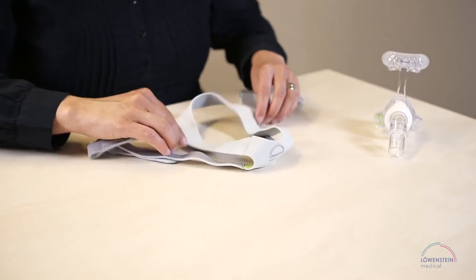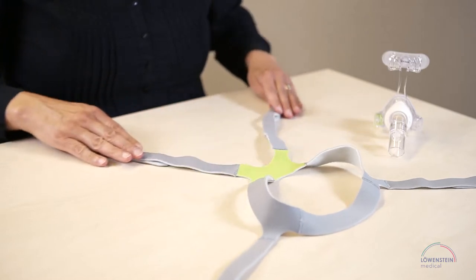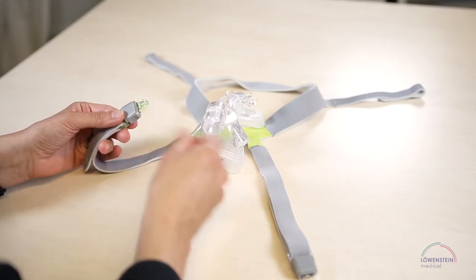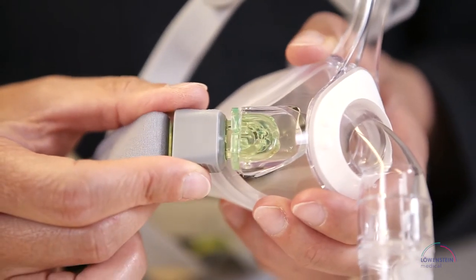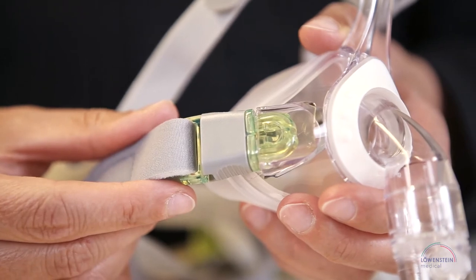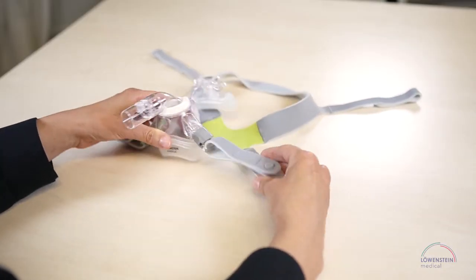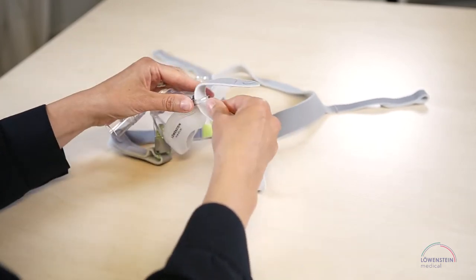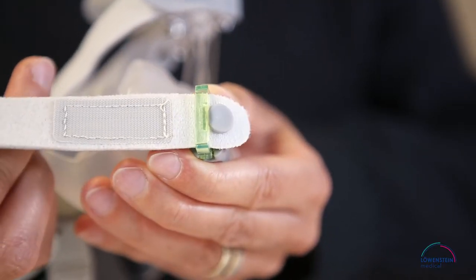The Joyce 1 family also has color coding. The inside of the headgear is marked with a green cross. Connect the green clip to the green matching part on the mask and the transparent clip with its matching part. Thanks to the silicone stopper, the color coding remains when you disassemble the straps.